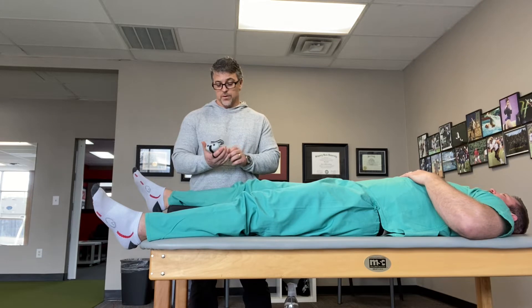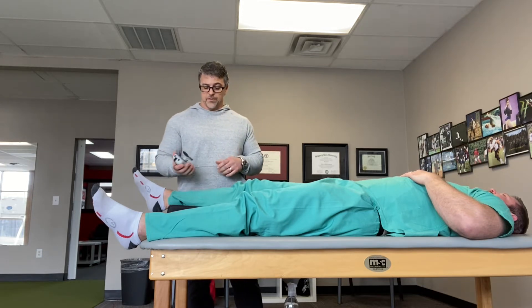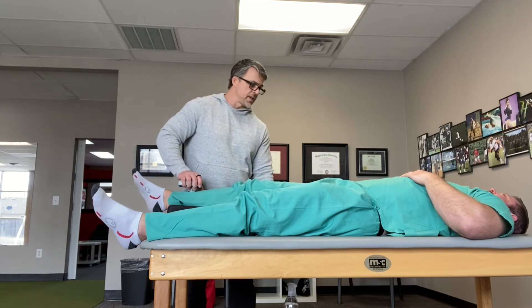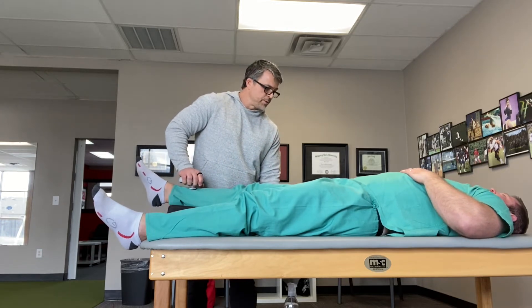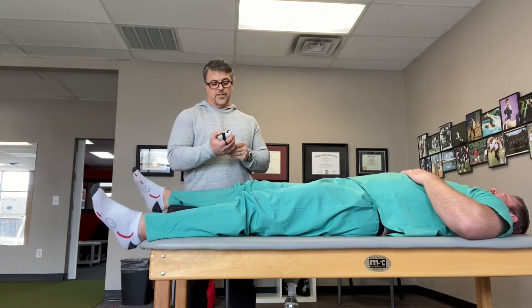So what I'm going to have John do is — we've got him on a bolster here so we're at the same angle before and after. I'm going to have you push up as hard as you can until you hear the second beep. Push, push, push, push. Good. So 47 foot-pounds.